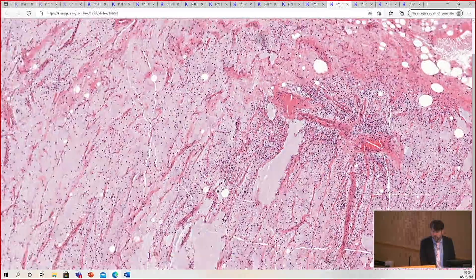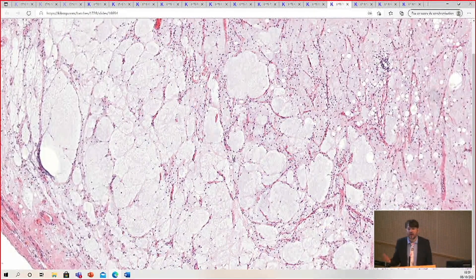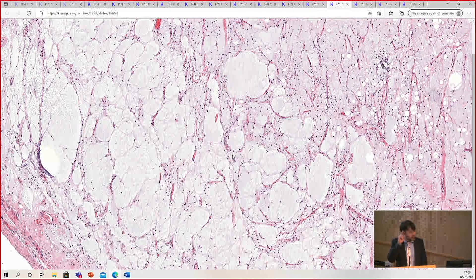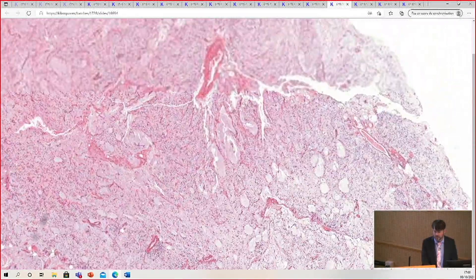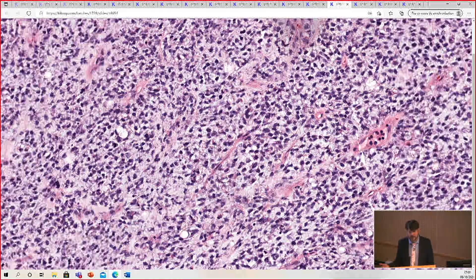Myxoid liposarcoma often has big pools of myxoid change. Sometimes it's so prominent that people have described it as the pulmonary edema pattern — like in an autopsy lung. Only a subset of cases have it, but it's a useful clue when you see it. This case also has areas that are much more cellular and round blue cell in appearance. When you start seeing the cells get bigger, touching and overlapping, this used to be called round cell liposarcoma — the new terminology is high-grade myxoid liposarcoma.